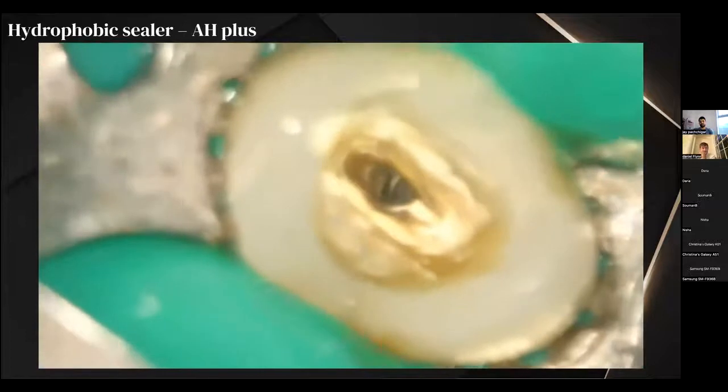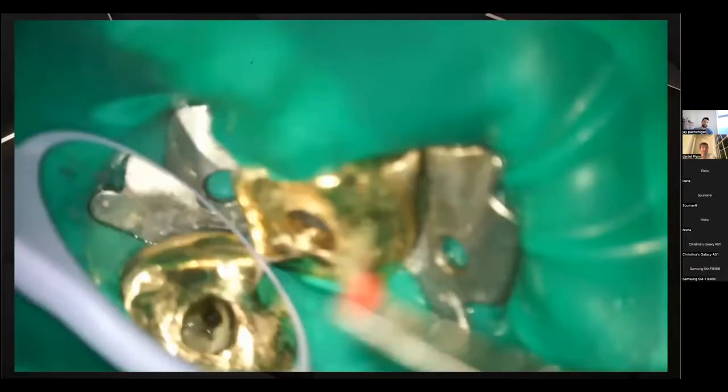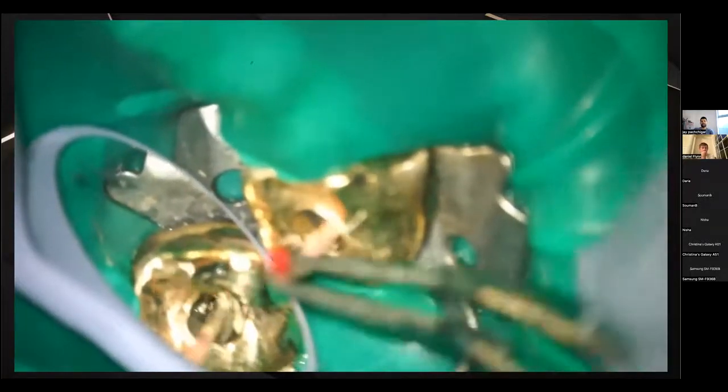If you are using a resin-based sealer, it would be good to try and coat that canal and actually check, instead of just placing the cone once to length, which I definitely did back in my NHS days. Sometimes it does take a bit of effort to coat that whole canal. In more extreme cases, again unlikely to happen every time, you just won't get any sealer down into those canals at all. And in this one, you'll see I actually did put a bit of effort into getting that sealer in, and there just wasn't much getting down those canals.